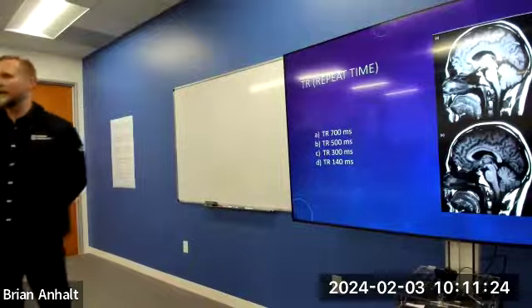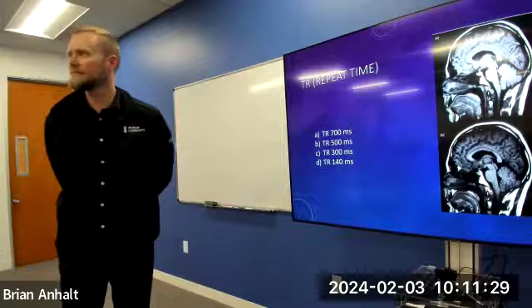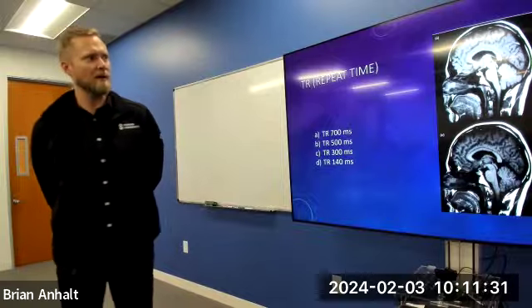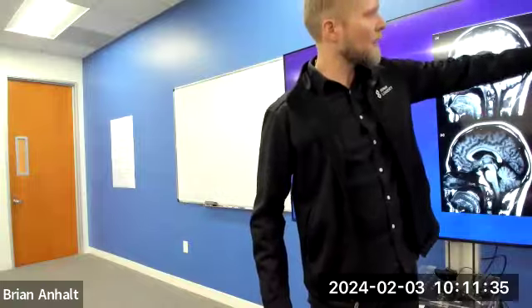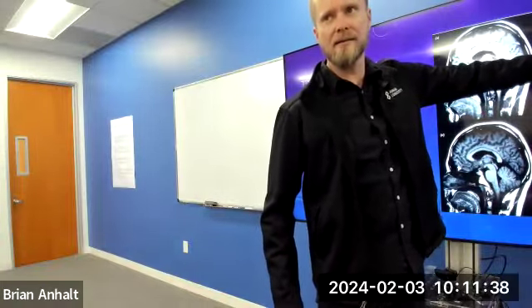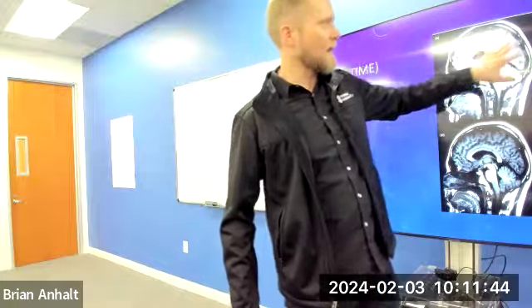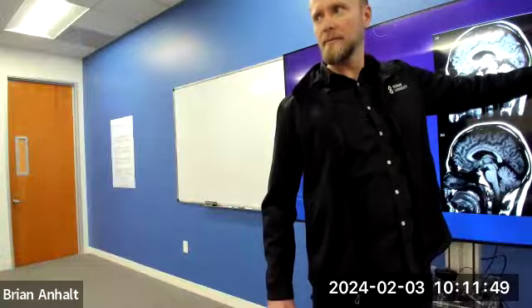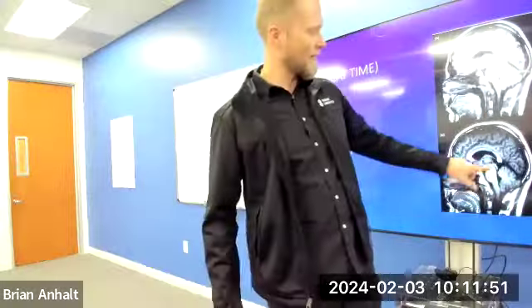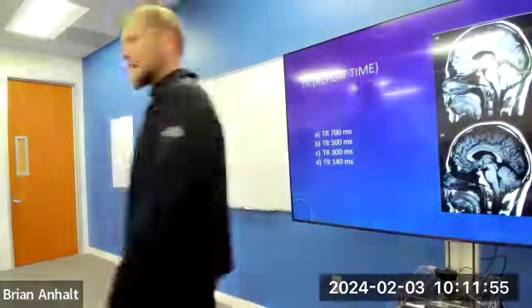Look at the white gray matter contrast in B. Right? There's a little bit better contrast here. The white gray matter, you can see it a little bit better. Even though this one is slightly more grainy, it has a little bit better contrast than this one does, right? So you can see I'm sacrificing SNR for T1 contrast, right? But I can't go too far, right? This is starting to look bad. And then you can't even see anything at all, right?